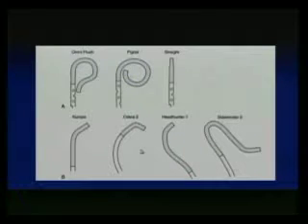For renal vessels, a headhunter, sometimes you can use in the carotid, or Sidewinder, or Simmons 1, Simmons 2 for a bovine arch if you want to do a carotid intervention.